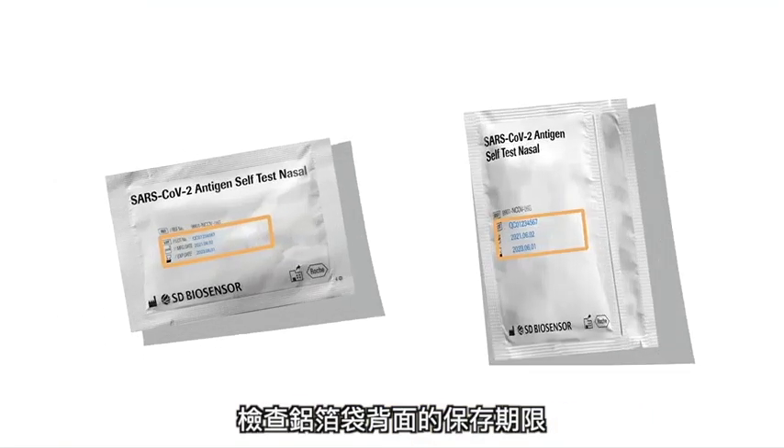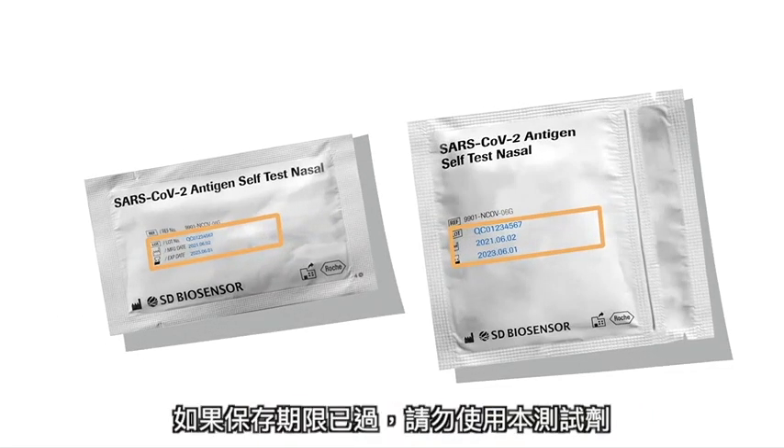Check the expiry date on the back of the two foil pouches. Do not use the test if the expiry date has passed.